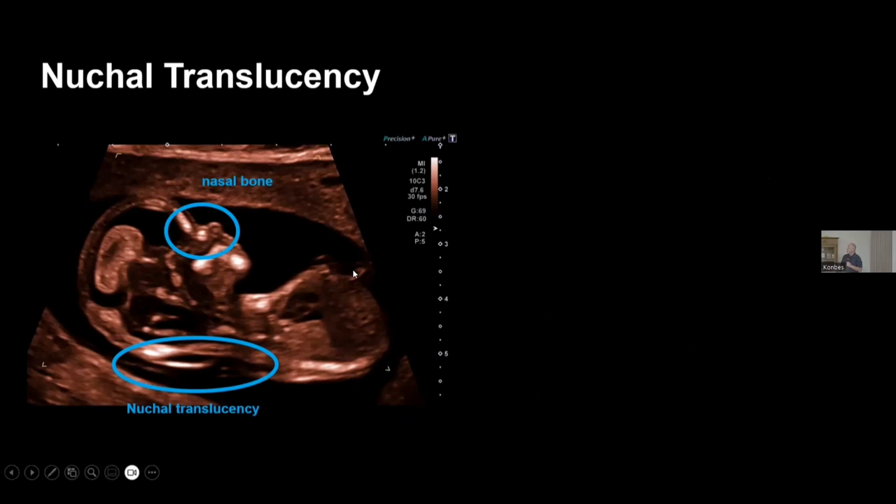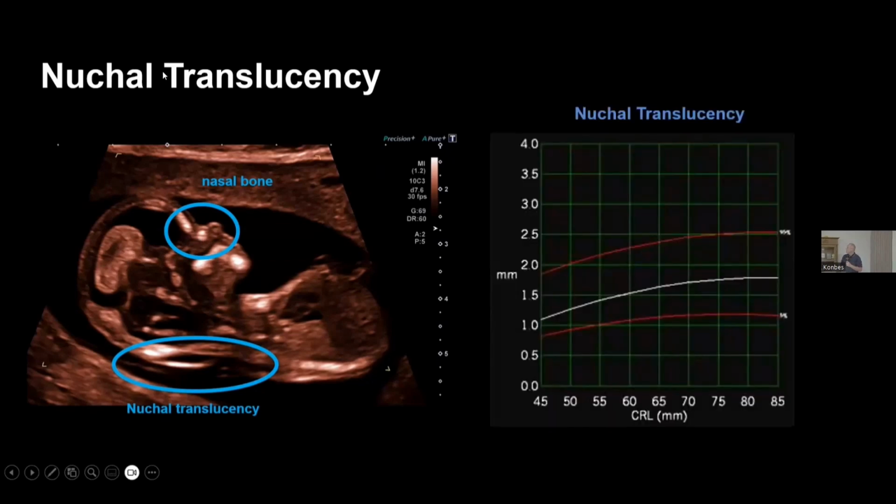So what should we detect at this early age of pregnancy? This was the nuchal translucency, this fluid in the neck, and also the nasal bone we can detect. And if we see this, we can reduce the risk of trisomies very much. But it's difficult. Of course, we have to magnify. I'll show you later. The values are around 1 to 3 millimeters. So that is the resolution today. And we have to magnify, we have to improve all our images to detect and evaluate all the structures. We can see also structures within the brain.